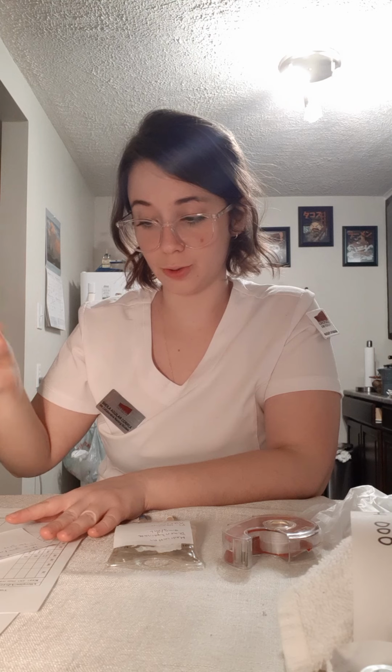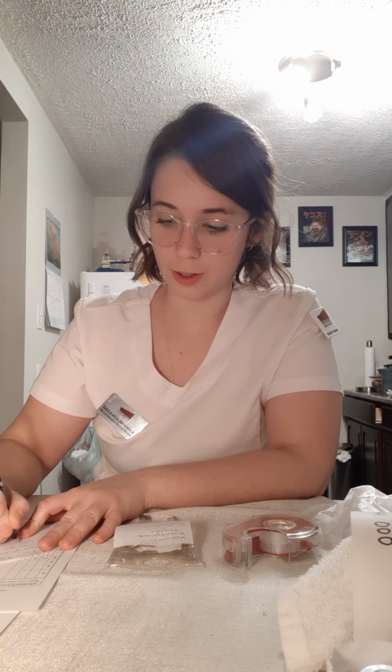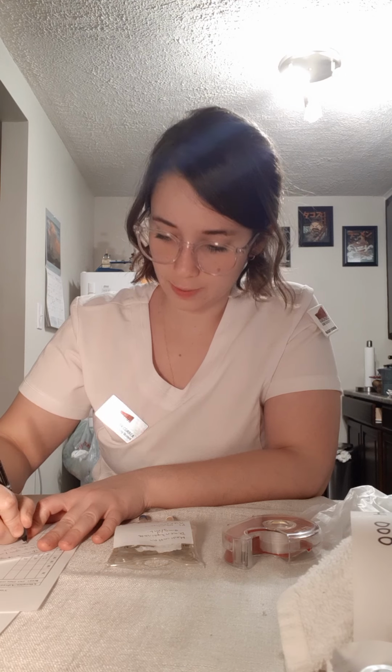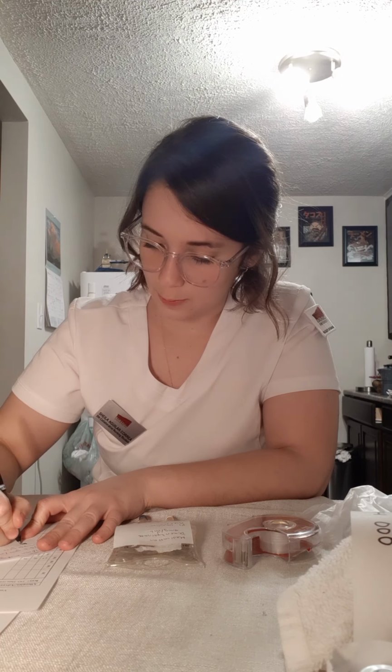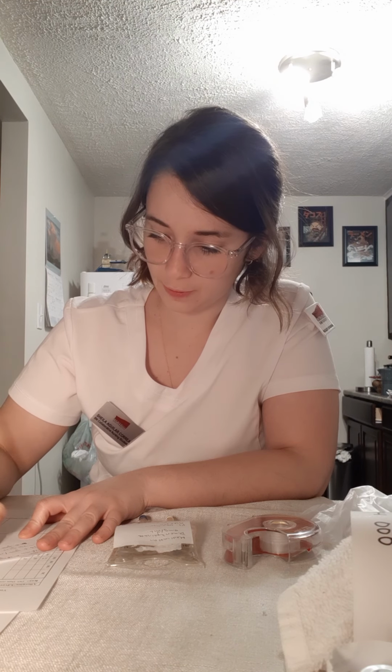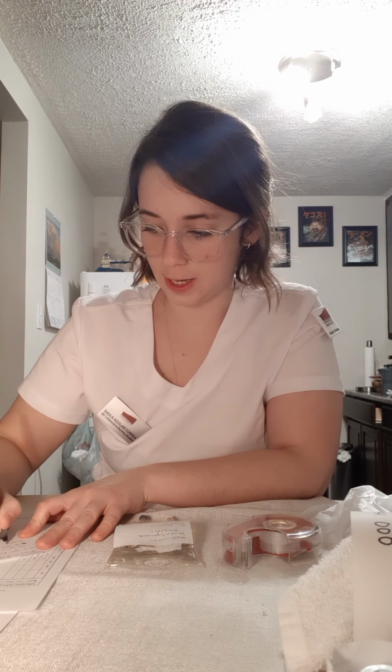And just so I know better, I'm going to count that over 15 seconds. So I'm going to divide it by 4. So it's going to give me 6.5 GTTs per 15 seconds. So approximately 7 GTTs in 15 seconds. That's going to be my drip rate: 7 drops for 15 seconds.